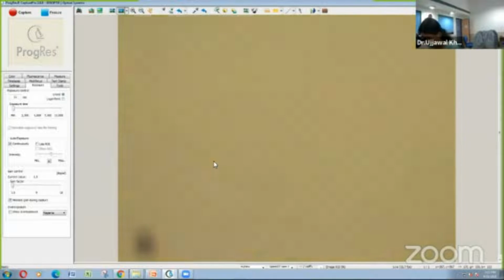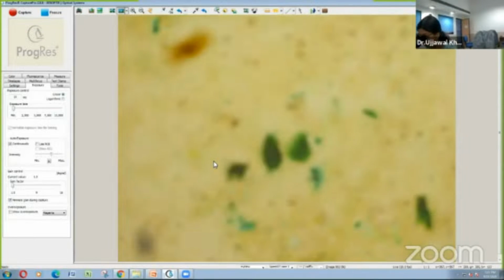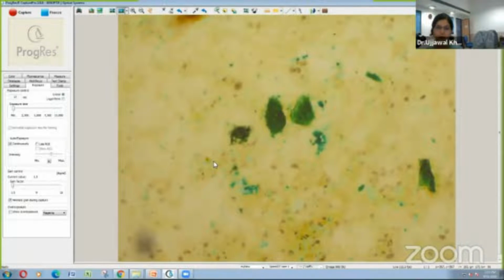They are also known as capsular dots, and they are very strikingly present in these alveolar casts or foamy exudates. Some of them are intact. The GMS again revealed and highlighted these eosinophilic exudates.